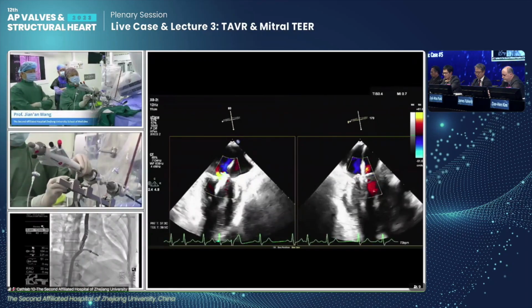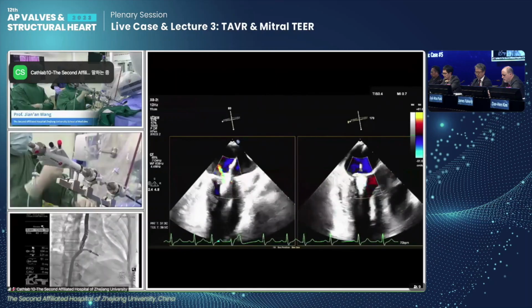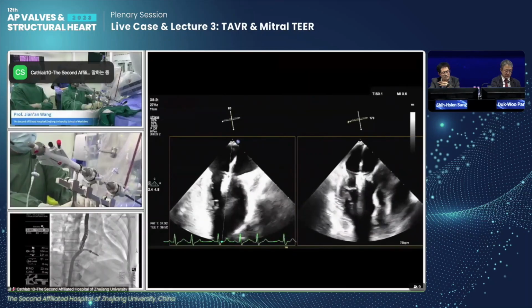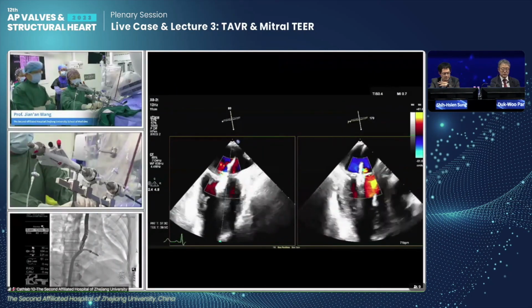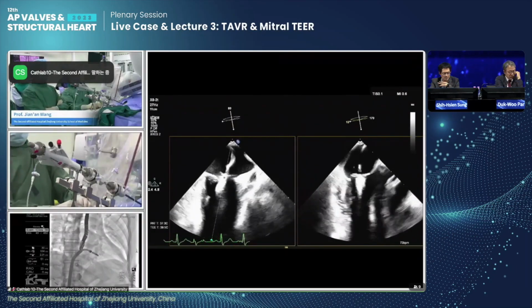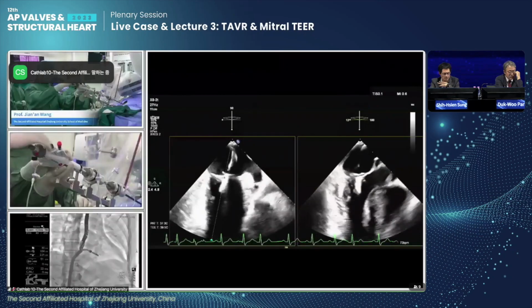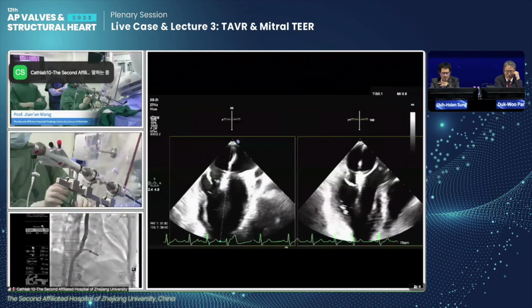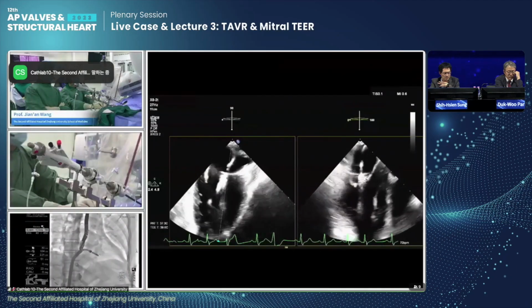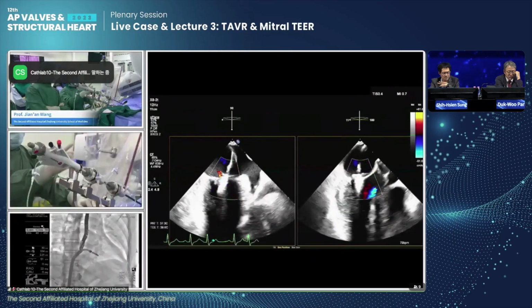We don't really have the posterior from medial. 其实反流已经好很多了，但是感觉是不是后叶会挺多的，lateral一点，但刚才medial一点可能就会好一点。关紧了吗？还没到完全到底部。关紧。好，下面再看一下，check一下。So I have tightened to the end. Yeah, we can check the color and residual. It's better, become much better.